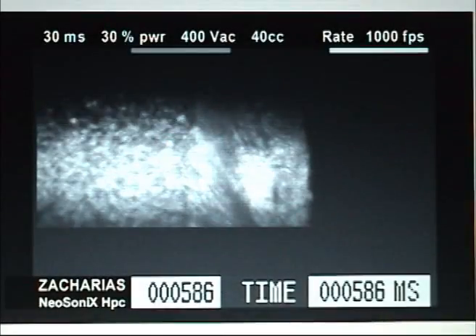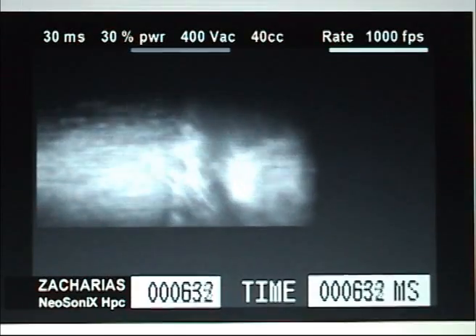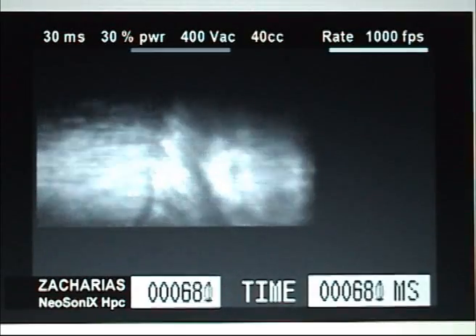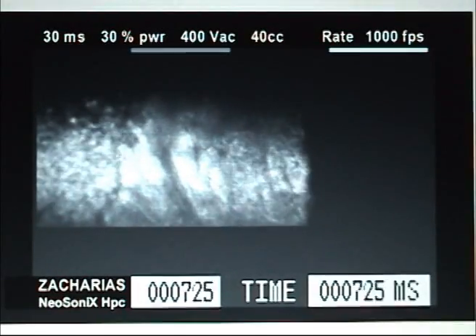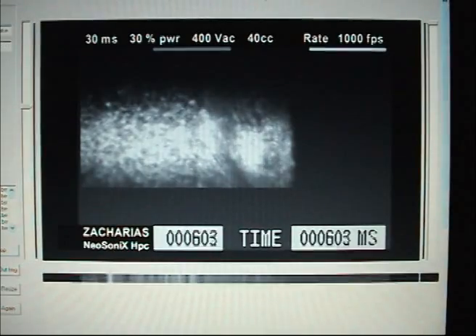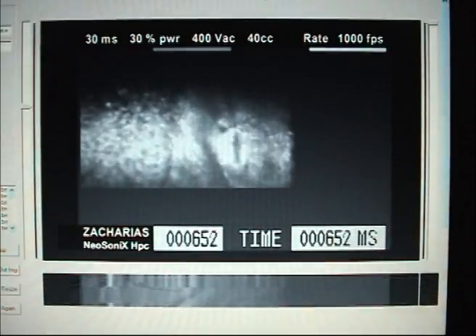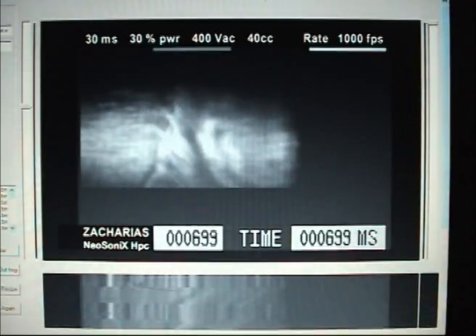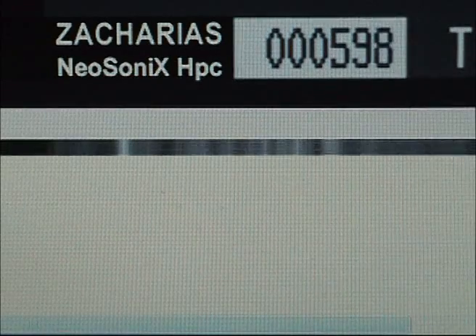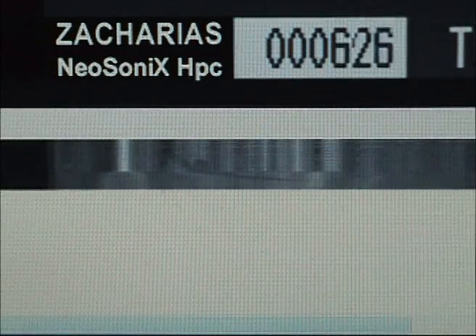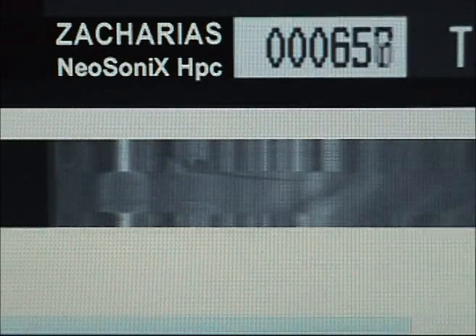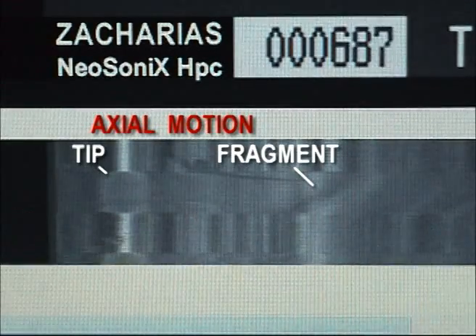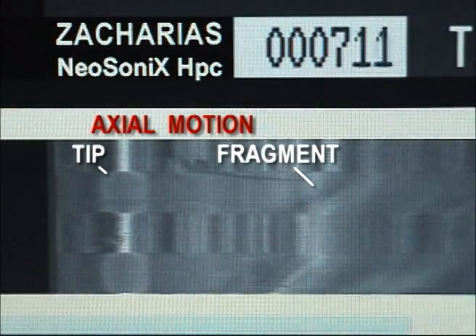The high-speed video recordings were processed using custom-designed image analysis software to track the axial displacement of the FACO tip and of the lens fragment. We obtained composite images representing axial motion versus time.